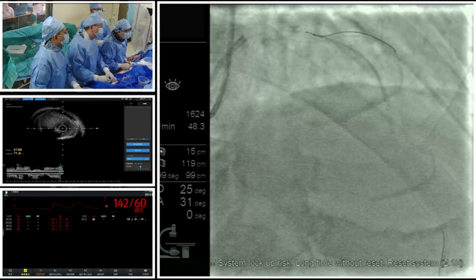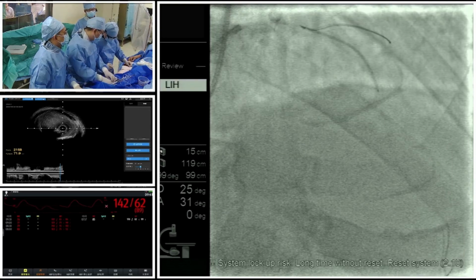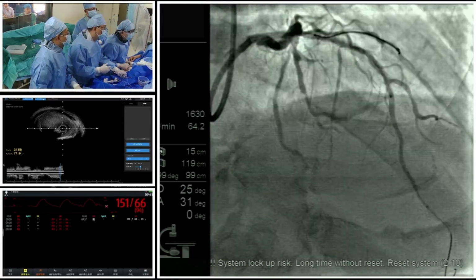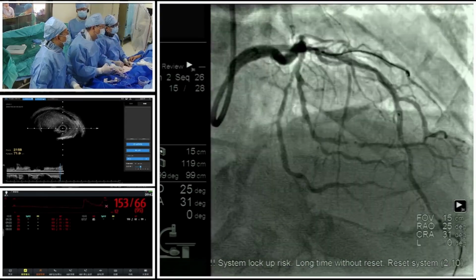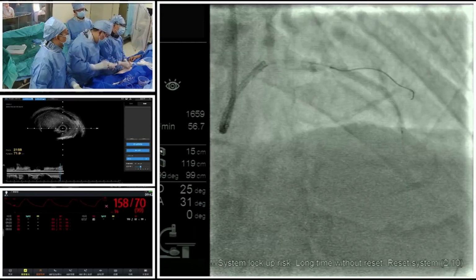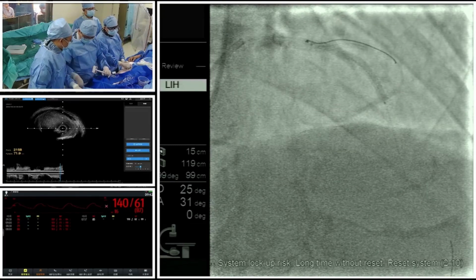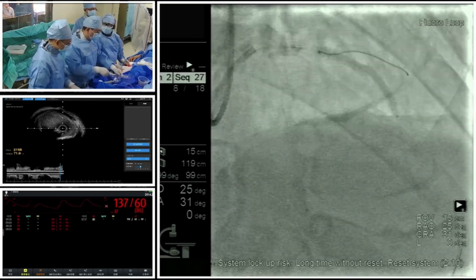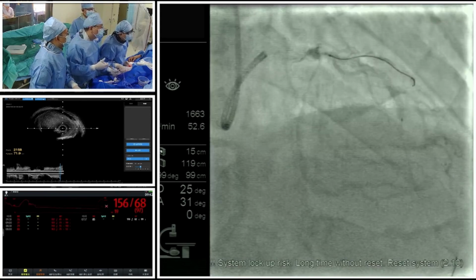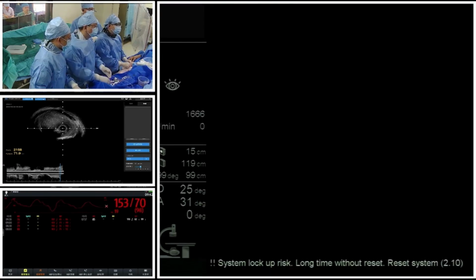Now, in the past years, we know when we treat the calcification lesion, we have only the rota in China and some scoring balloon or cutting balloon. As we all know, Professor Gong is a high volume rota operator. But today, Professor Gong chose the rotatripsy strategy. Why do you choose this strategy, Professor Gong? Why do you choose rotatripsy, but not the rota alone or the IVL alone?